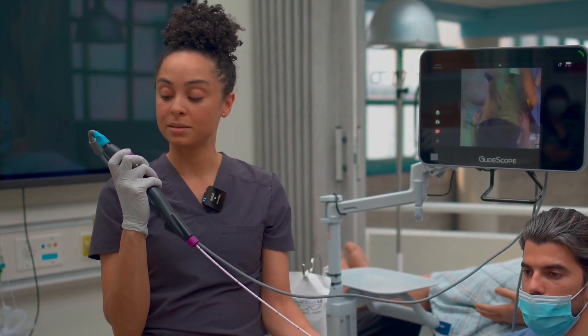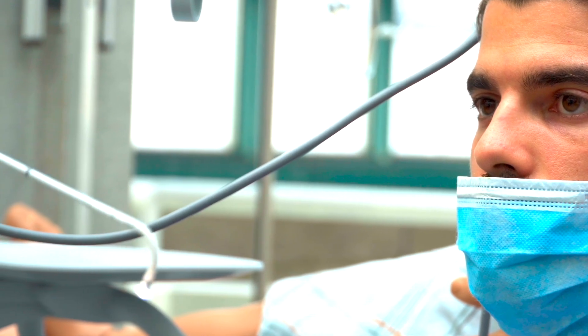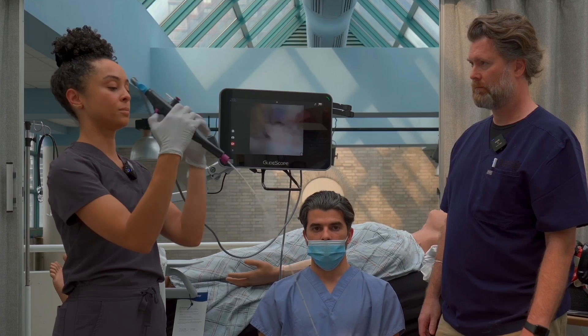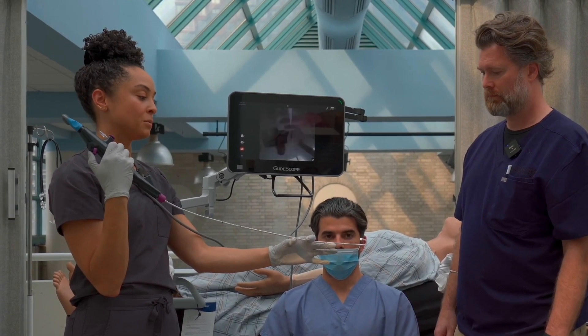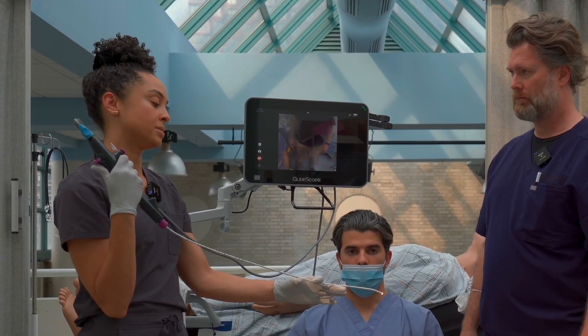So for example, it's important to know — for this scope, this is finger driving. When I move it up and down I know which direction it's going to go. Alternatively, you can thumb drive, which some people are more comfortable with. I'm just checking that when I move my thumb in one direction or the other, I know which way it's going to go when it's inside the nose or inside the throat. That's an important first step before scoping the patient.